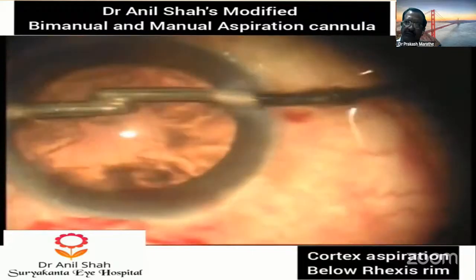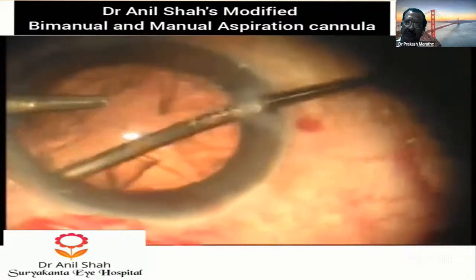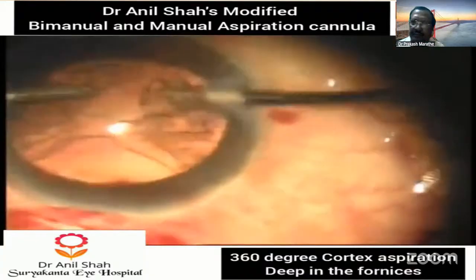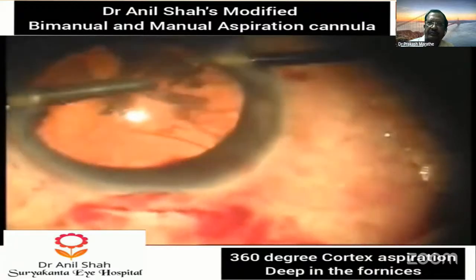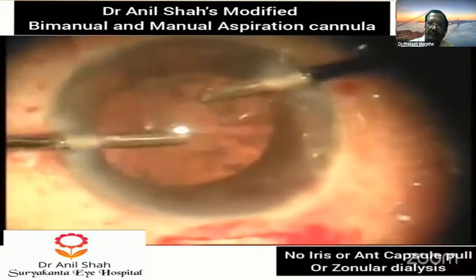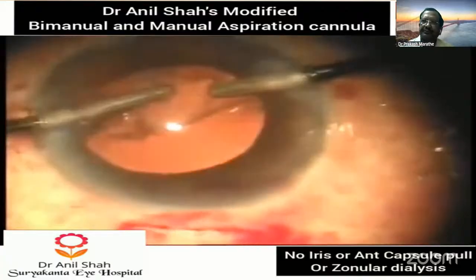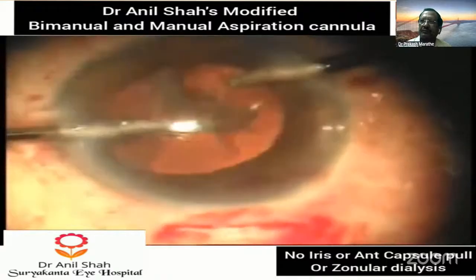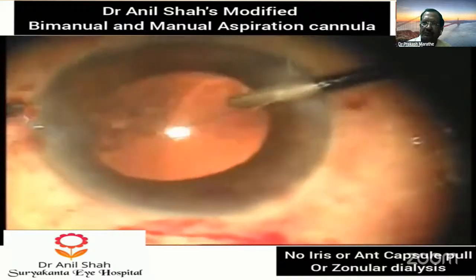It is going deep into the capsular rim, crossing the capsular rhexis margin deep into the fornices and removing the cortex easily without catching anterior capsule or iris or even the fornices of the capsule. With this, it is a very safe removal without any tension of catching anterior capsule or even the equator of the capsule. The cortical cleanup is completed.